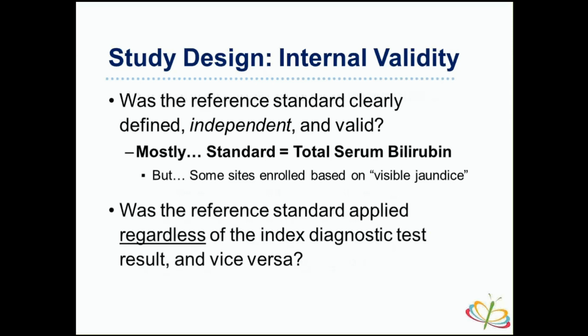Was the reference standard applied regardless of the index diagnostic test and vice versa? The answer is yes. The total serum bilirubin was applied regardless of the BiliCam bilirubin and vice versa.